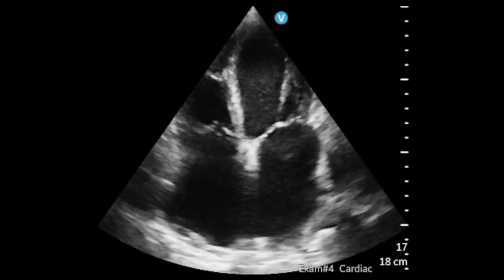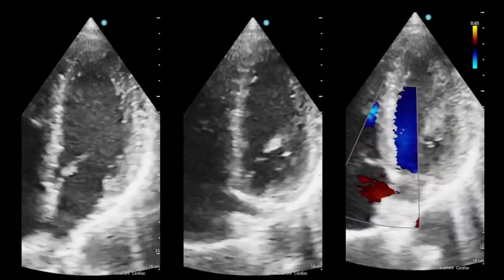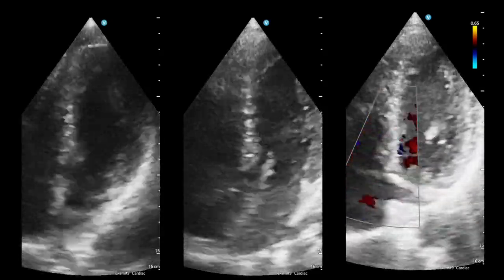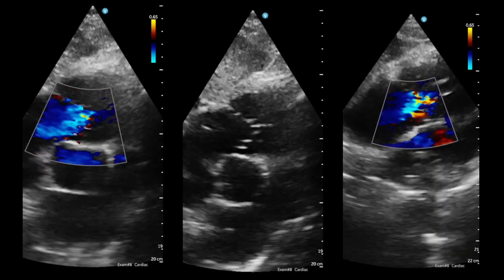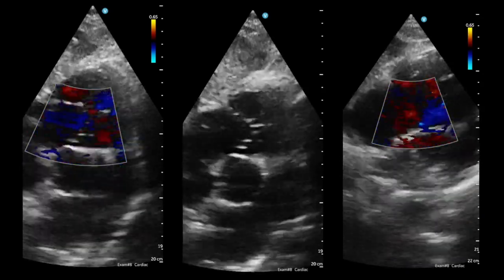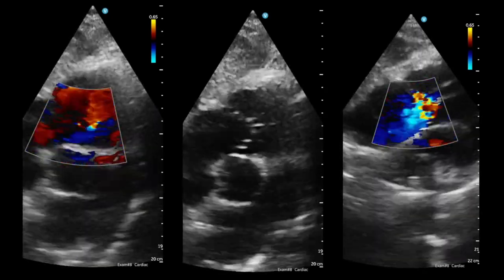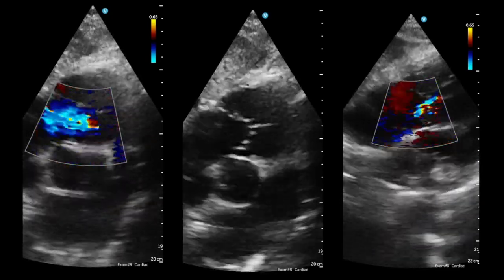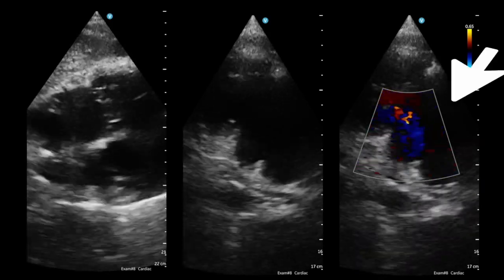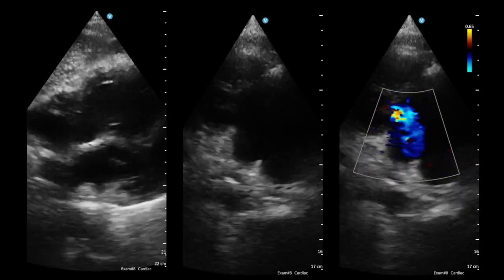This was a game-changing scan because this patient was deemed not suitable for intensive care. Here are other images demonstrating normal partial four-chamber views going into five-chamber views with addition of colour flow. Some of Marcus's images: subcostals moving into the subcostal short axis view — on the left some colour flow showing regurgitant tricuspid flow over the top of the aortic valve, same situation without colour flow showing a clear RV failure situation. Really good images. Marcus also has an inflow view demonstrating a significant tricuspid regurgitation jet.